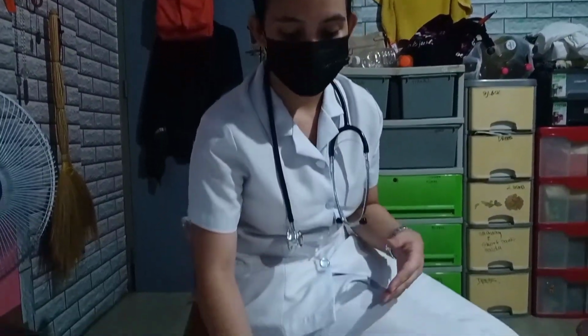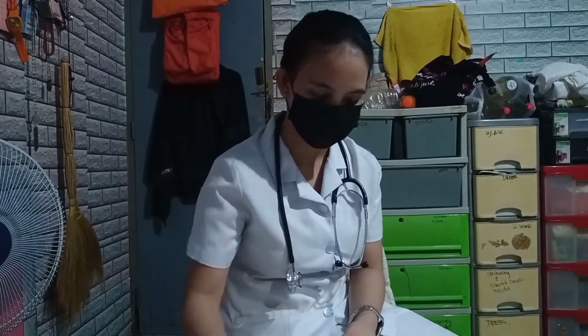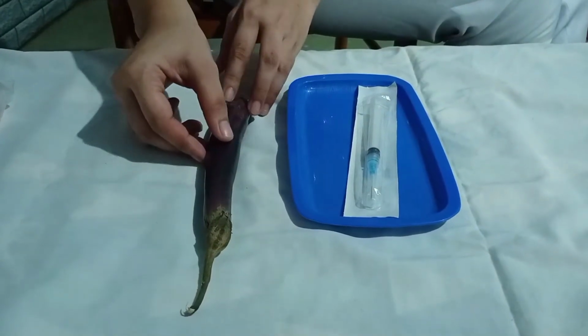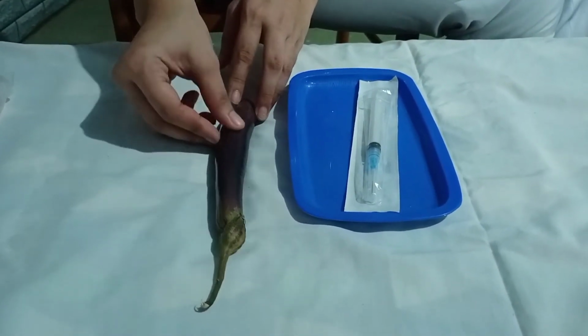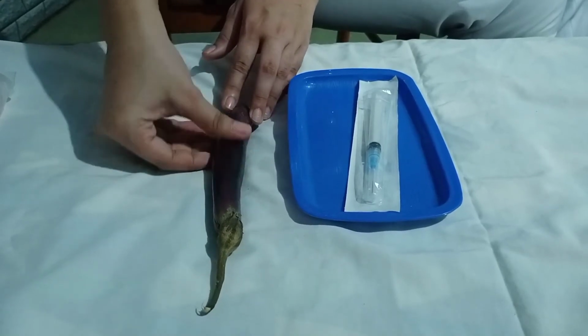So, now I'm going to locate the site of the injection. Since we are in a pandemic now, I found another way to perform the subcutaneous injection: I'm going to use the eggplant as my patient. I'm going to choose a site where the skin appears healthy and free from irritation and inflammation, to reduce the discomfort of injection.